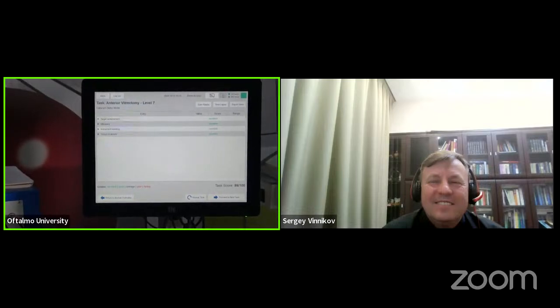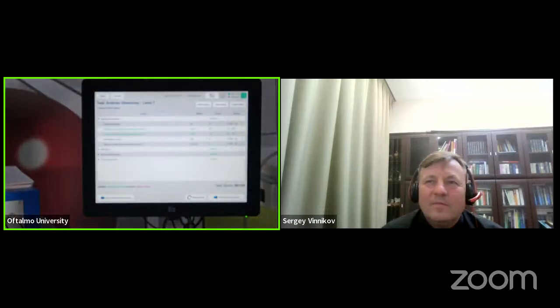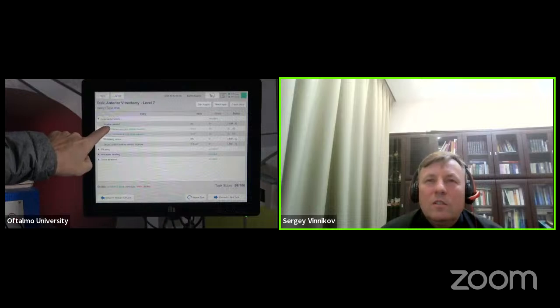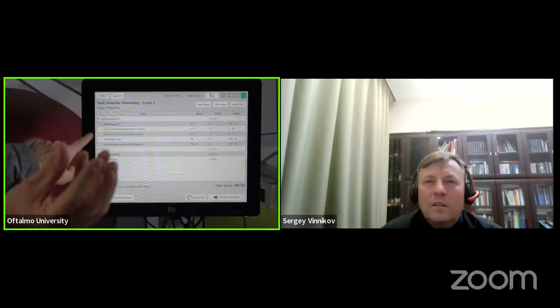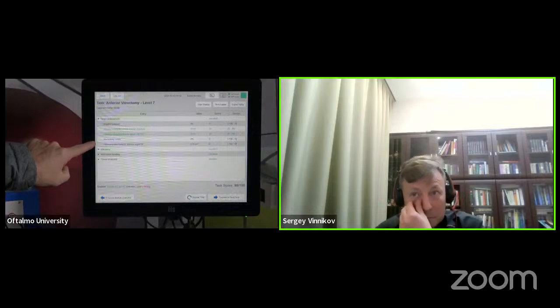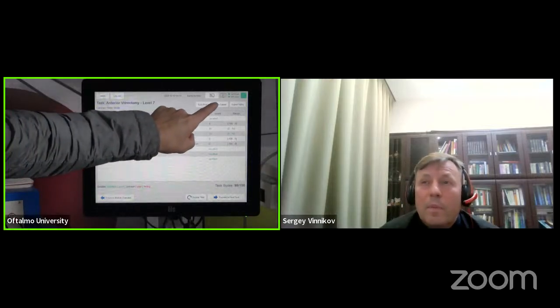The simulator first is going to tell you the metrics, okay? So we can understand what he did right. He didn't pause irrigation. There was no vitreous in the anterior chamber, no vitreous below the rupture, and he didn't pull vitreous from the back to the top.